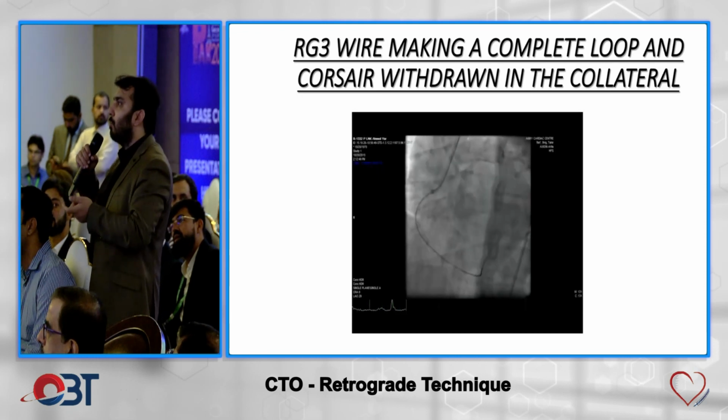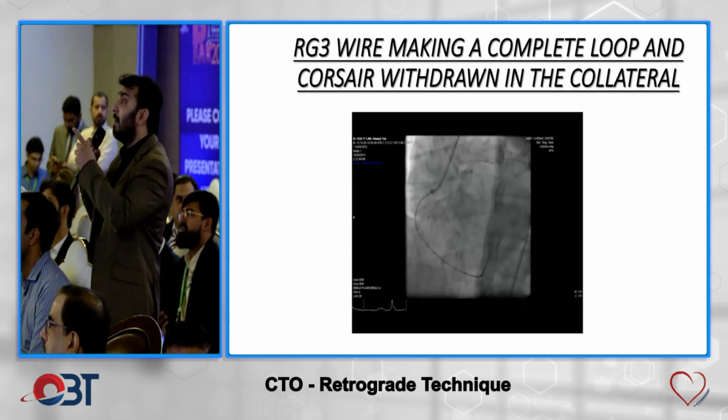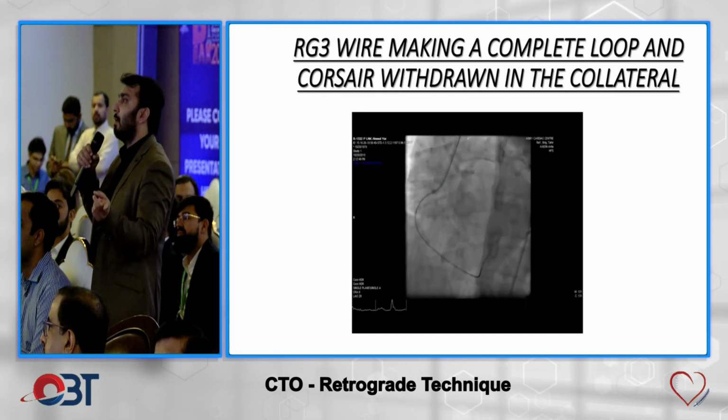So what can we do to externalize it? That is the main question. And secondly, where should the micro catheter be when we are externalizing the wire?